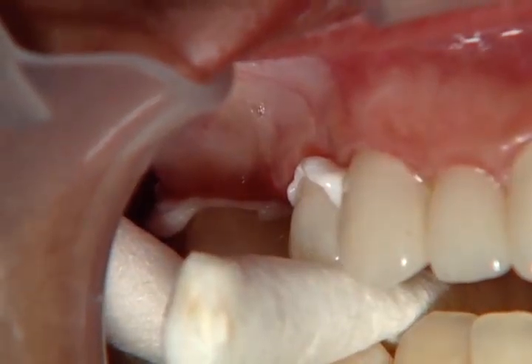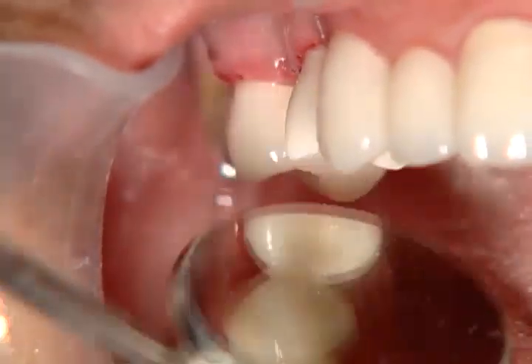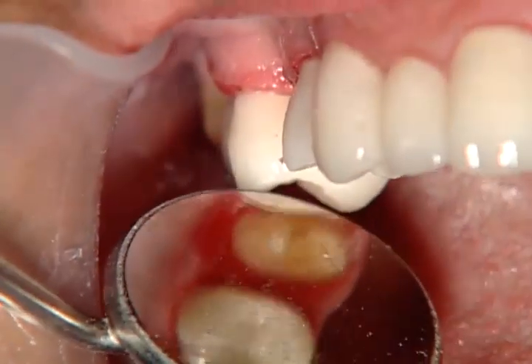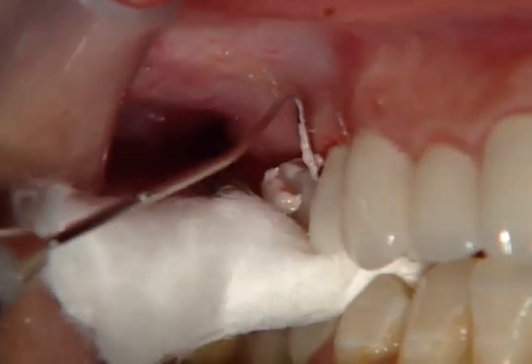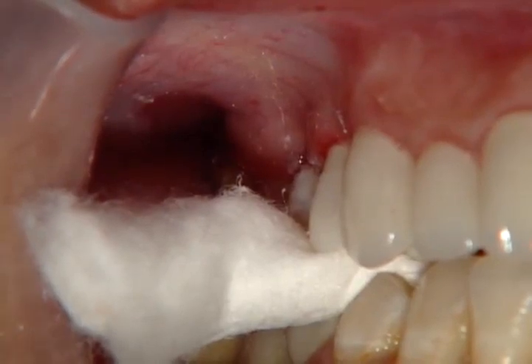And we've got this one tooth in the middle left that needs to have it cemented. And usually when we have contact issues, that's what we will do. If I'm trying to put things into place and they won't go, I will cement, in this case, the first bicuspid and the molar, and then try to seat the second bicuspid. And we had contact issues there, as we knew we did. But it allows me just to work on one tooth as though it were a single unit crown and the other two teeth were already there.